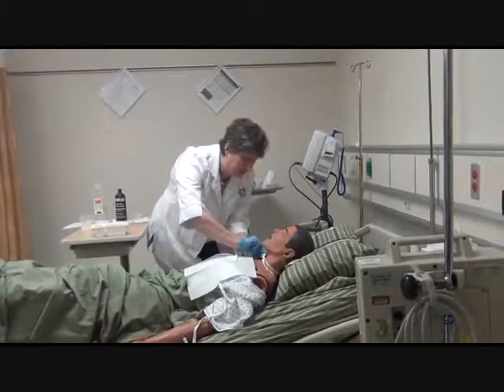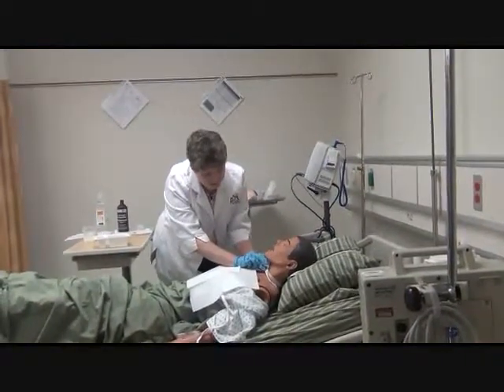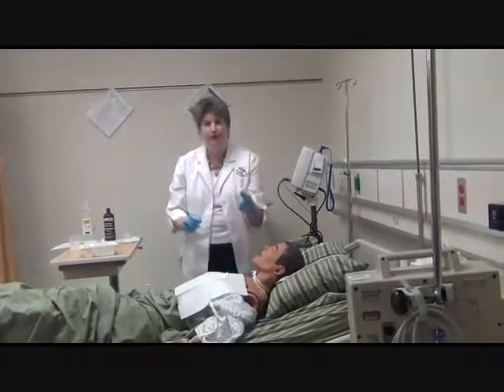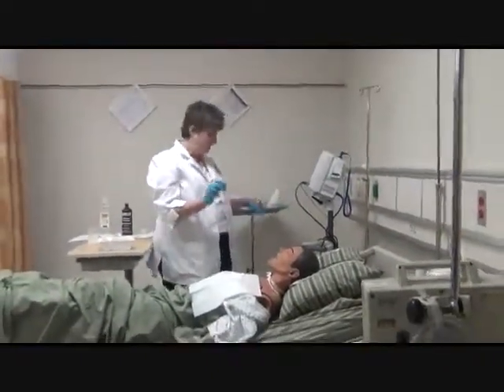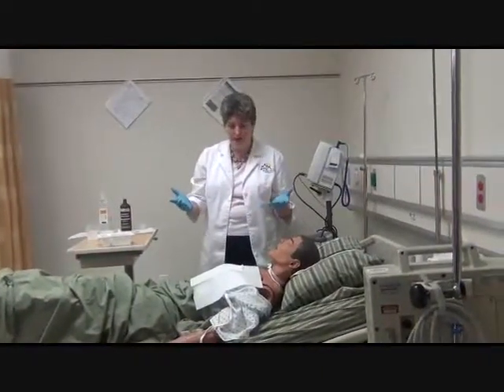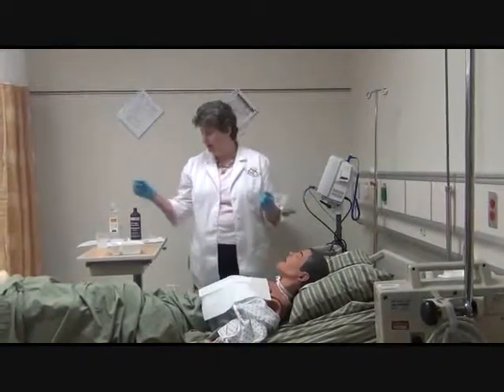and I was taught pretty much work from the front. Now, in this case, it's kind of a tight little fit on this side. That's when those tweezers come in handy. But your gauzes in real life, when they're wet, they get pretty small, so it's easy to get in behind that face plate. If the face plate itself needs more cleaning, then I need more additional gauze. Usually they give you about 3 cleaning gauzes. Okay?